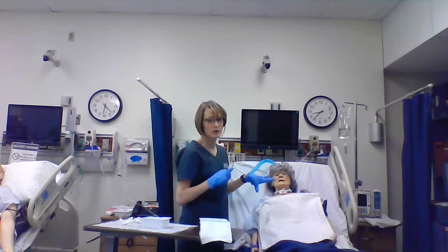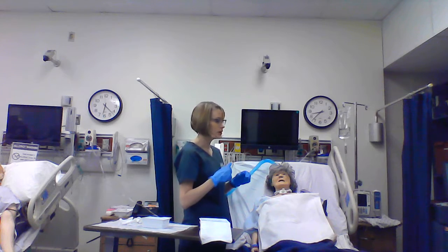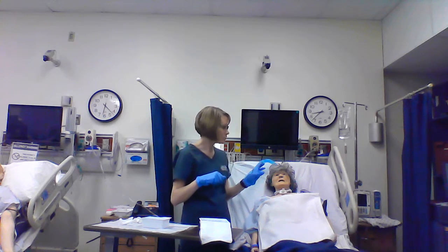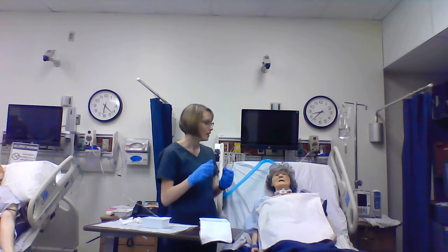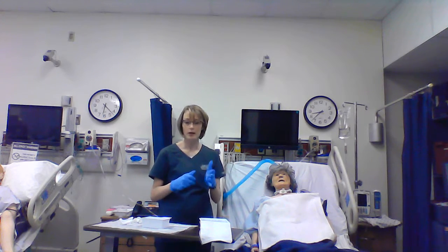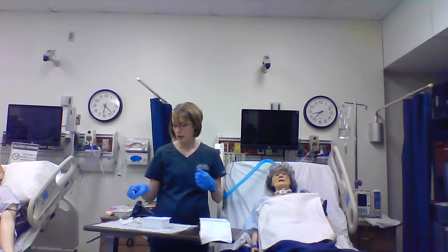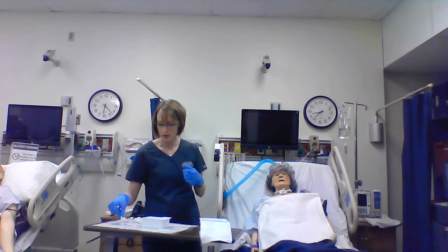So her trach ties look really good. I'm going to leave them in place. They're extremely dry. They look clean. I didn't get them damp whenever I was cleaning. So I'm going to leave the trach ties that she has on in place. I would doff these sterile gloves, wash my hands again, and then I would don new sterile gloves a third time, and then get ready to replace her V-sponge.